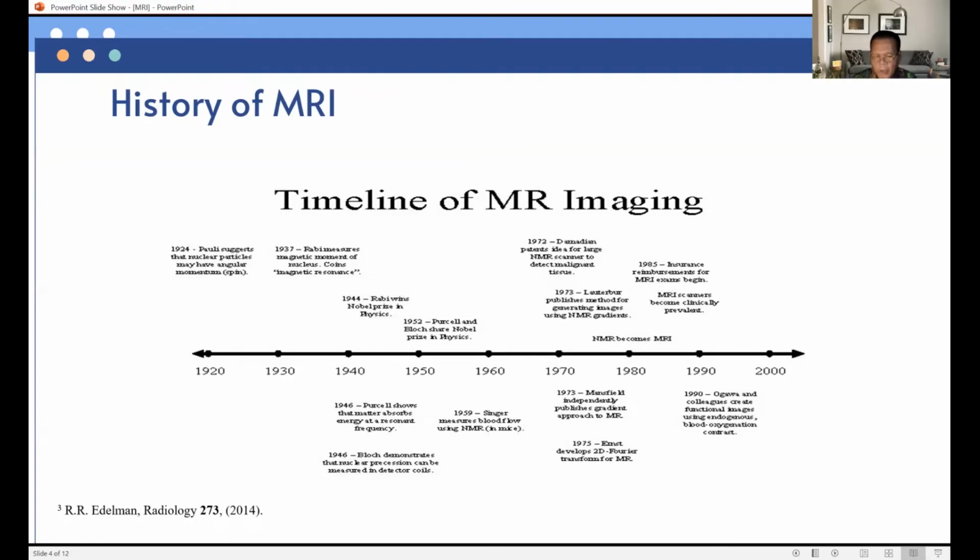Contrast agents, often containing the element gadolinium, may be given to a patient intravenously before or during MRI to increase the speed at which protons realign with the magnetic field. The faster the protons realign, the brighter the image.